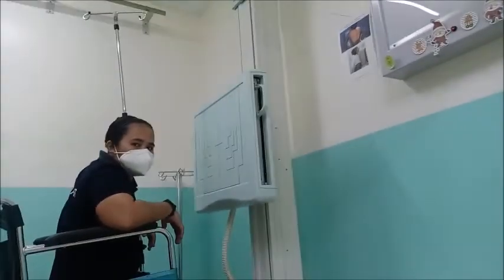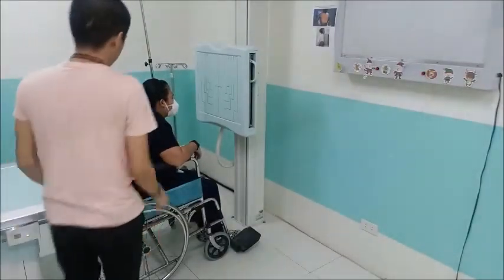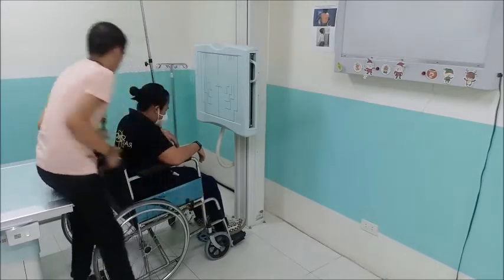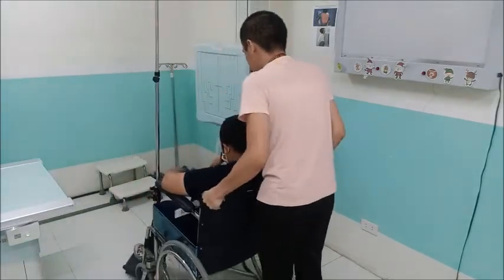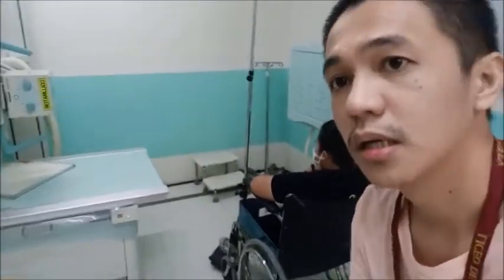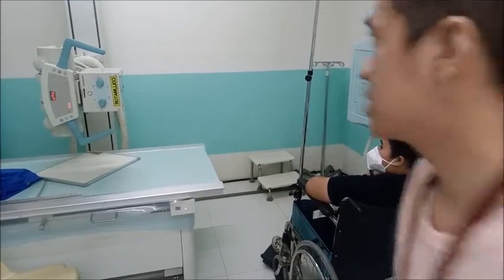Okay, so in cases nga dili ikatindog si patient, magamit to nato ang gibuhat ganina kadto sa X-ray tube. Atong gidirect ang X-ray tube towards this side.